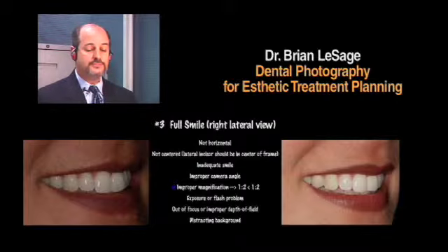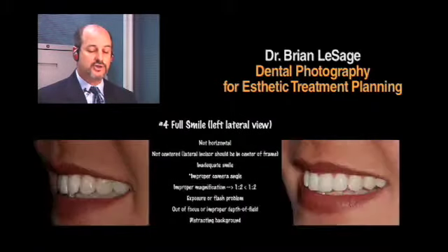The way I teach it is if there was a diastema between the lateral and the canine, or the lateral and the central, you should be able to see between it. You should be able to see between that diastema. That's how parallel we want to shoot. We'd like to obviously see the full commissure lip, not too much distraction over here. And we go to the left side, same thing, the lateral splitting the X and Y plane, pretty close. Not too much distraction over here.